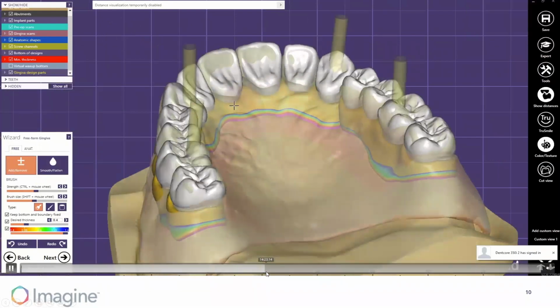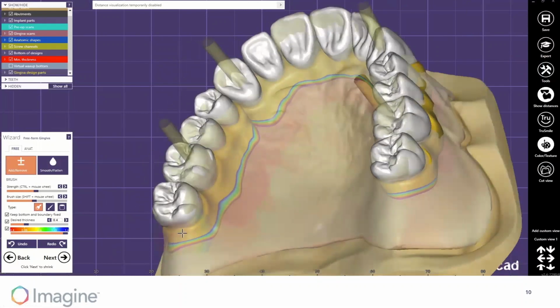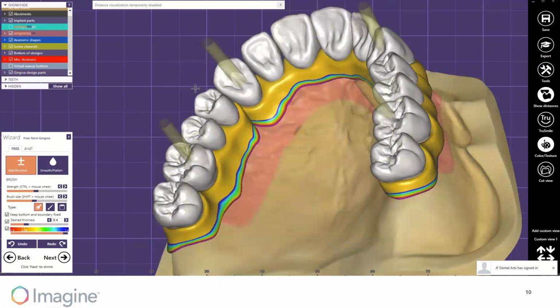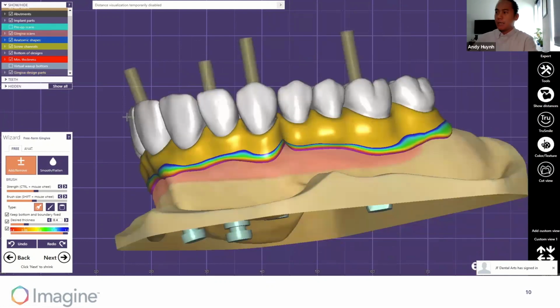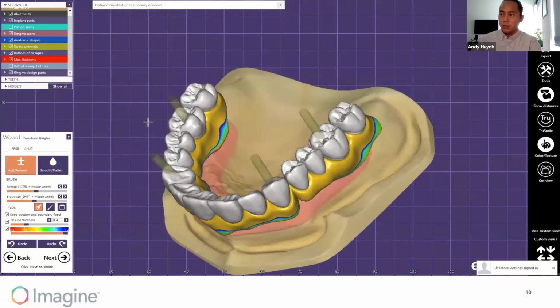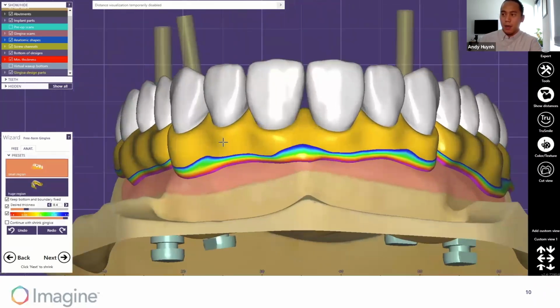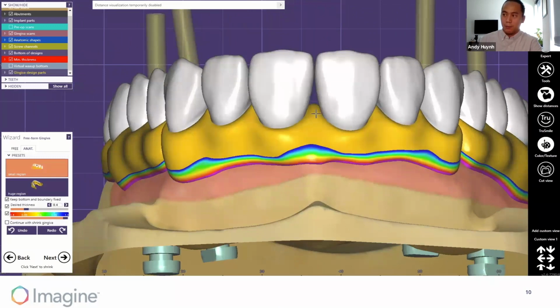Hey, Andy, real quick question from the audience. Nikolai wants to know, can you adjust the screw channel size from default? The screw channel size from default. So that's going to be, we didn't change the option on my version of exocad, but I'll have to double check that. If he shoots me an email, I can give him a direct answer.